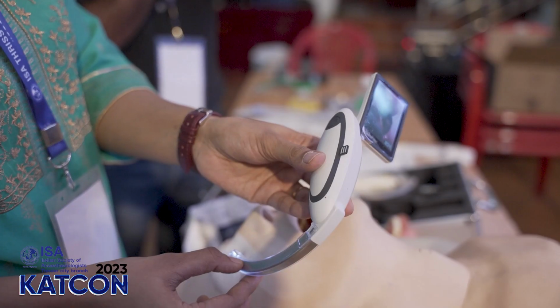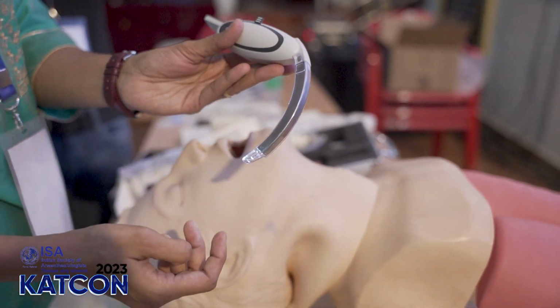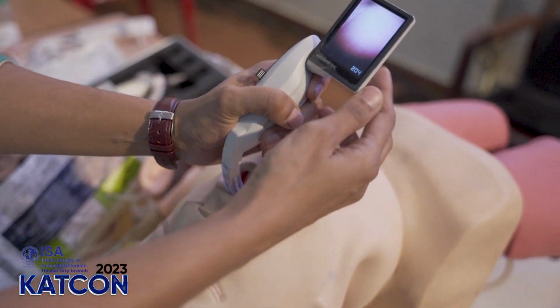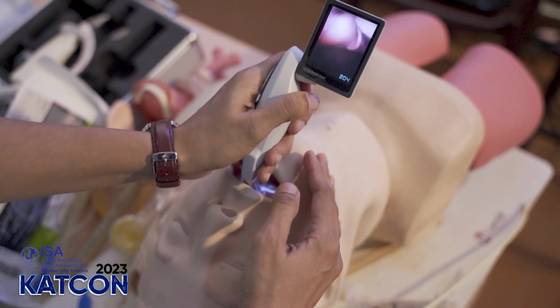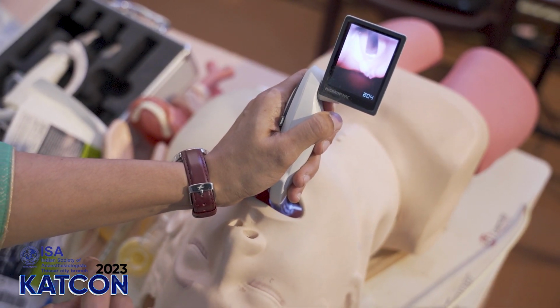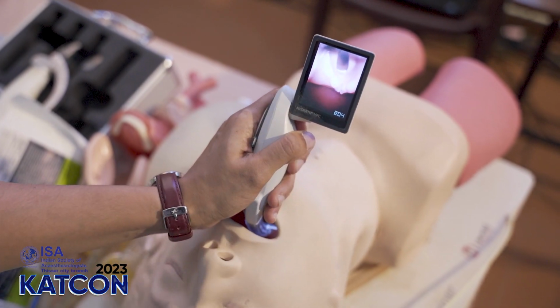If the blade is channeled, then you are supposed to preload the tube into the blade and then insert. You get a very good view of the larynx. We can see the structures inside, and seeing that, we can intubate. You get very good views of the larynx with these video laryngoscopes.